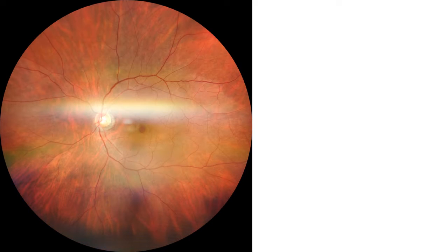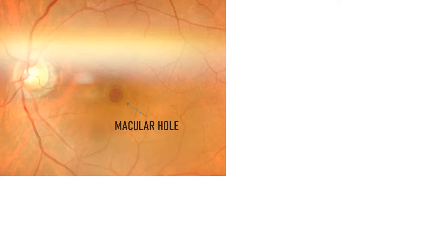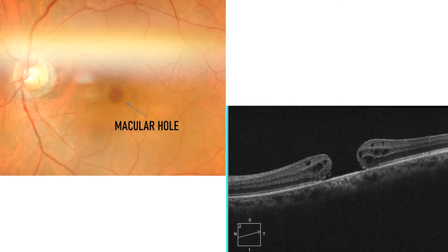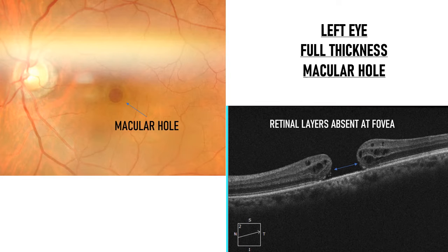Now in this second picture, this is the fundus photo of the left eye of a patient. At the center of this picture, i.e. in the region of the macula, you can see a circular area which is reddish brown in color. This is what a macular hole looks like, and this reddish color is due to the underlying choroid. Here is the OCT of this eye. You can see that the layers of the retina are absent at the fovea. So this is a case of left eye full thickness macular hole.